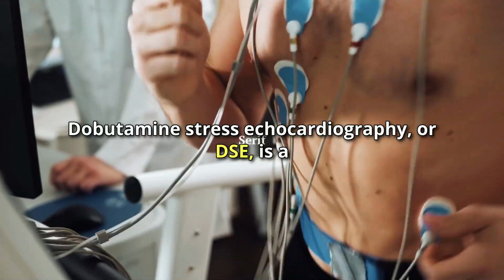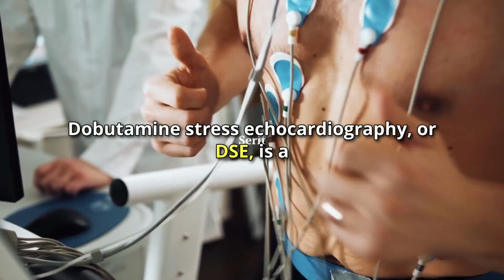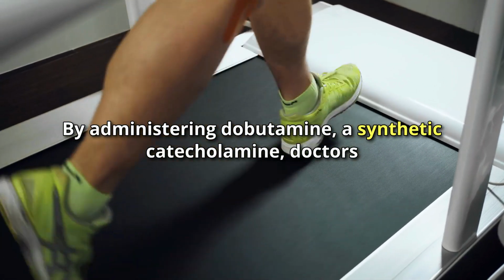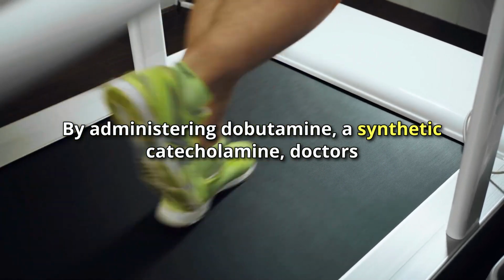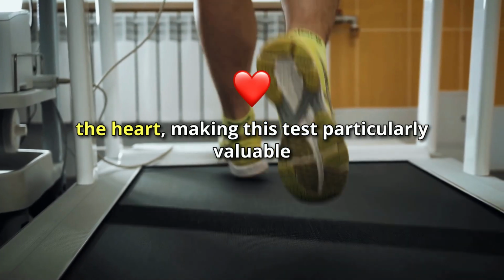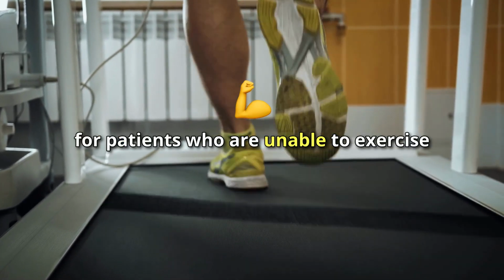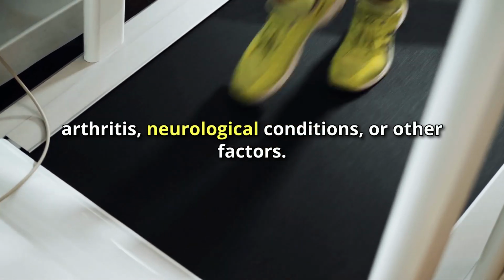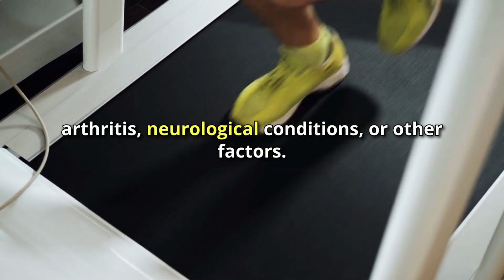Dobutamine stress echocardiography, or DSE, is a specialized test used to assess heart function. By administering dobutamine, a synthetic catecholamine, doctors can simulate the effects of exercise on the heart, making this test particularly valuable for patients who are unable to exercise due to physical limitations. Whether due to arthritis, neurological conditions, or other factors, DSE provides an alternative method to evaluate heart health.